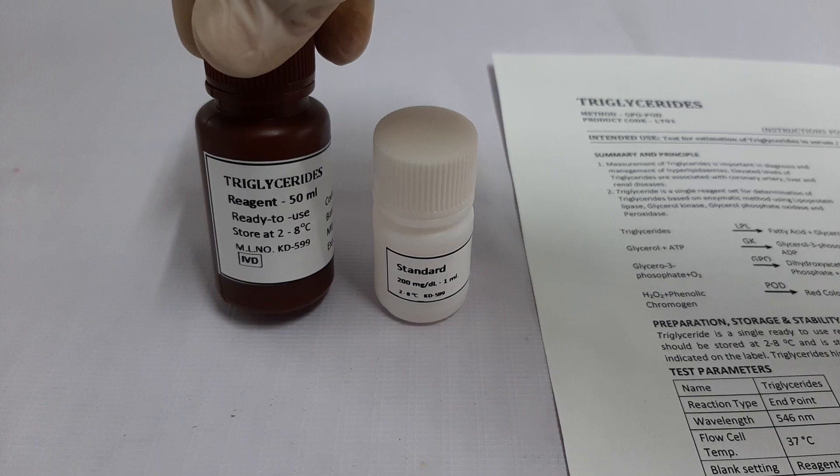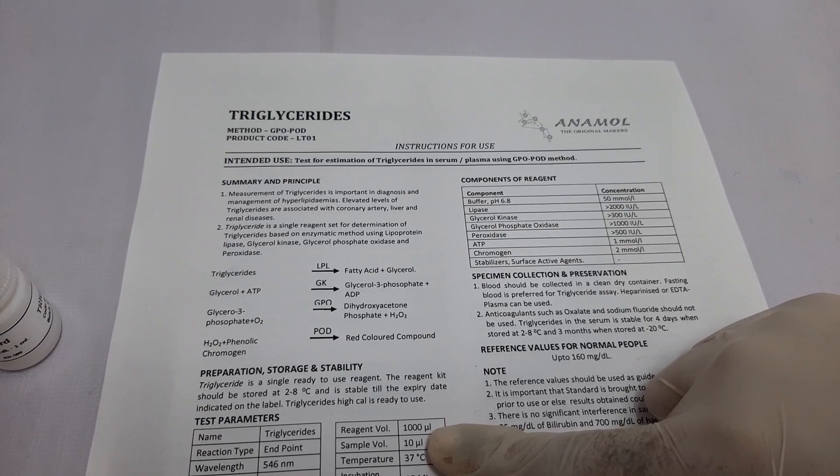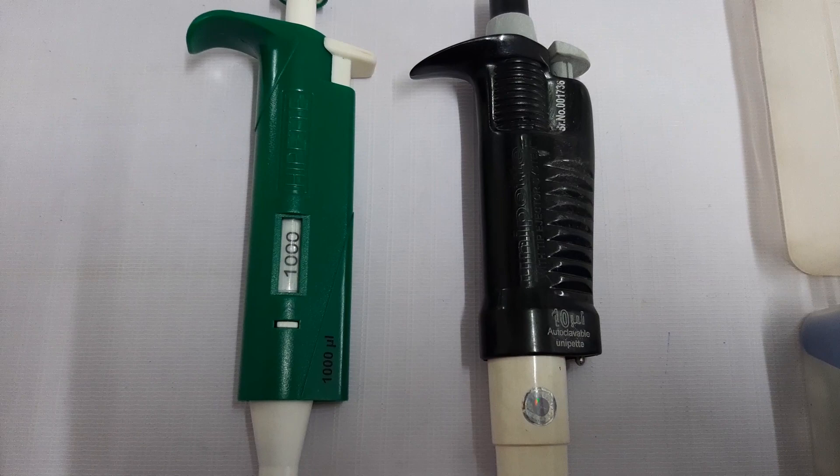The kit contains one bottle of triglyceride reagent, one bottle of triglyceride standard of 200 mg percent concentration, and the instructions for use. We recommend all users to read the instructions for use thoroughly before using the test.